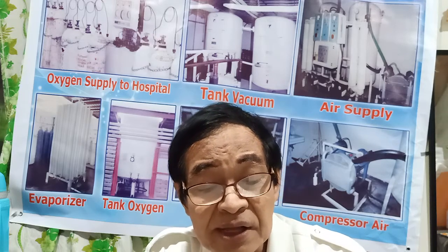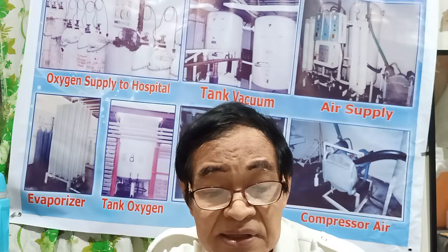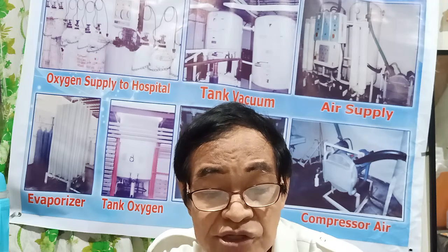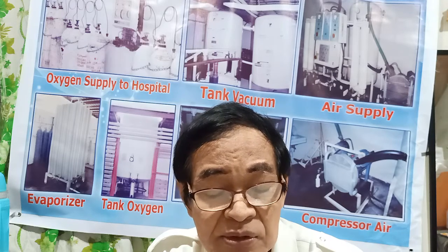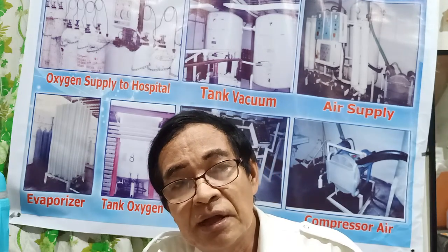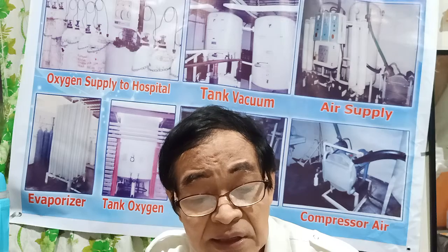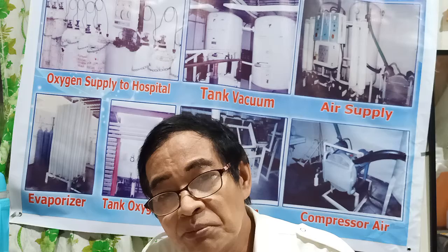Okay. Next, the protective clothing. Personnel handling cryogenic liquid must wear protective clothing that provides protection against contact with the cryogenic liquid and with cold components. You get some materials of protective clothing. That is very important in an emergency, for some of the nurses and doctors.